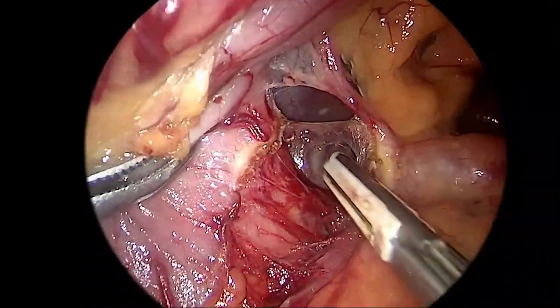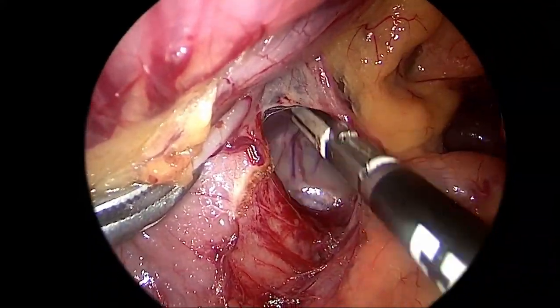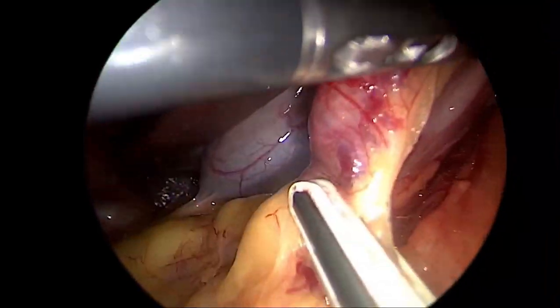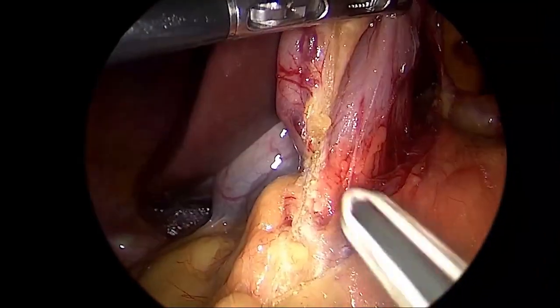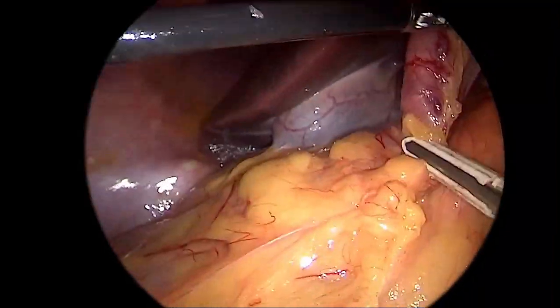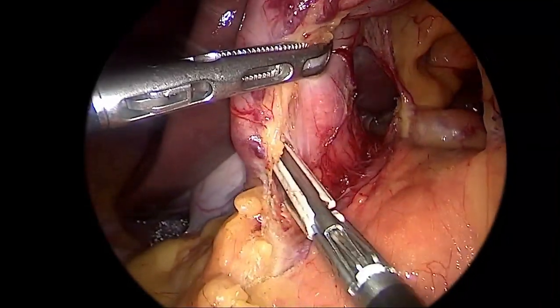The gastroduodenal artery is my main landmark. Now I have a good window. I can get more length of the duodenal stump by doing lateral dissection. The lateral dissection is crucial so that I can get more length of the duodenal stump for the anastomosis.